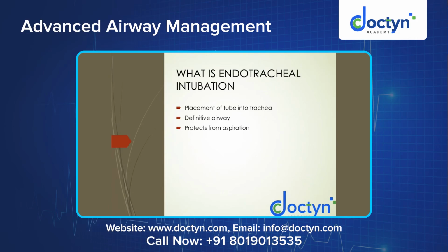So it is just a placement of a tube across the vocal cords into the trachea, which is called endotracheal intubation. This is a definitive airway, because you can maintain ventilation through a ventilator or through the ambu without any risk of aspiration, because the cuff is inflated. This will prevent aspiration, and it is a definitive airway which you can maintain for a longer period of time, unlike a supraglottic airway device, right? So this is endotracheal intubation.